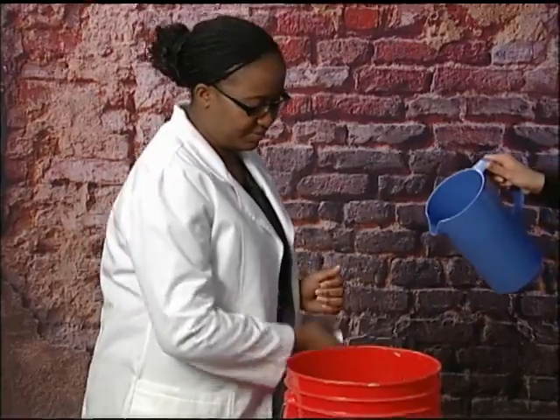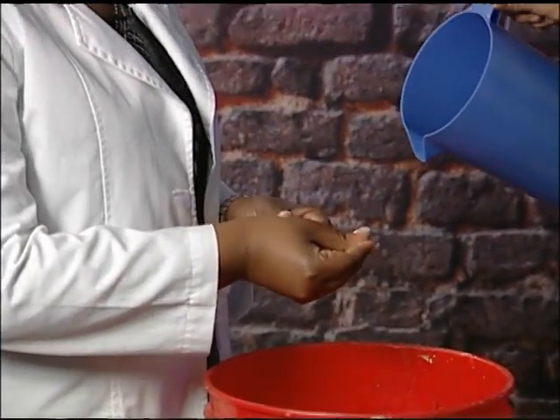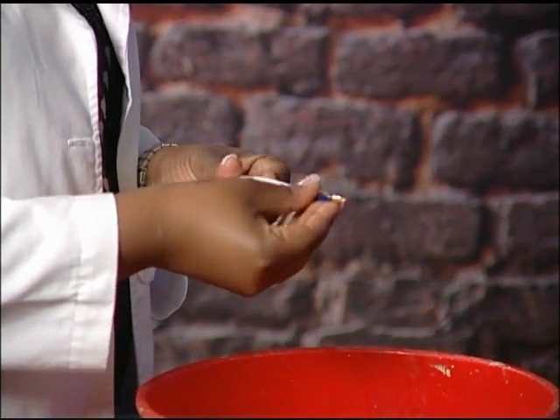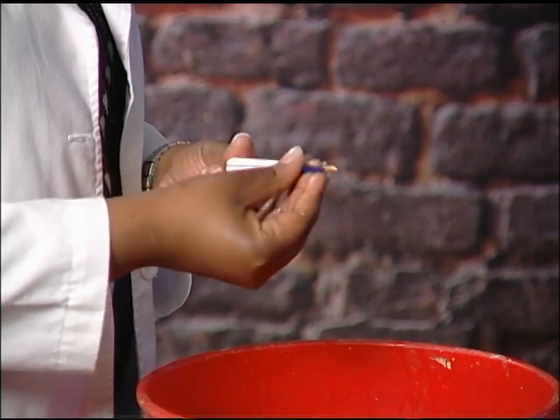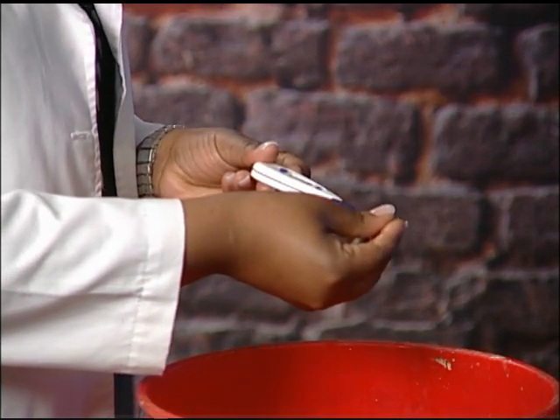To clean the digital thermometer with soap, rub soap on your hands. Then rub soap on the probe end part of the thermometer, being careful not to pour water on the electric part of the thermometer. Then rinse with clean water.